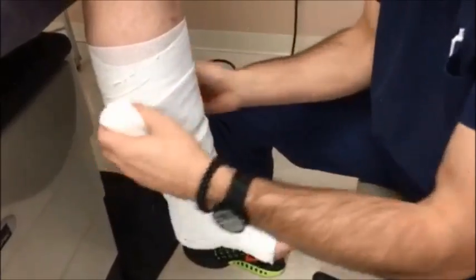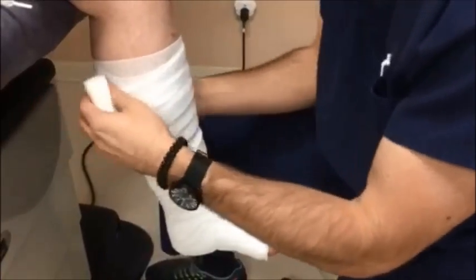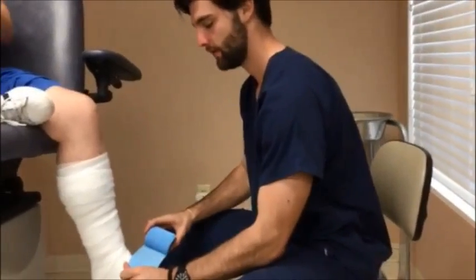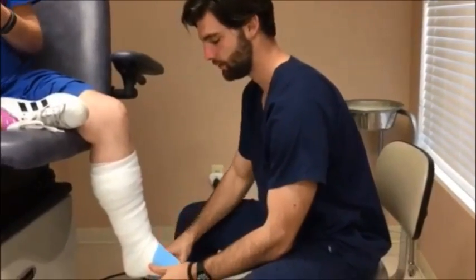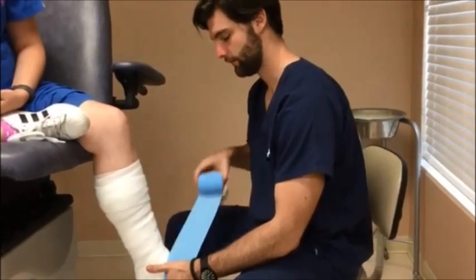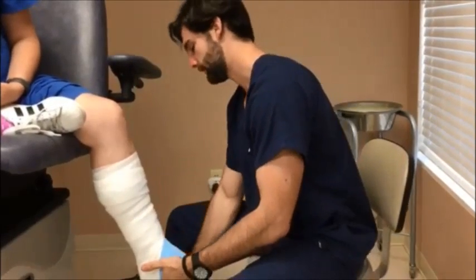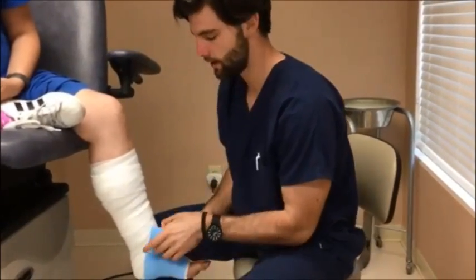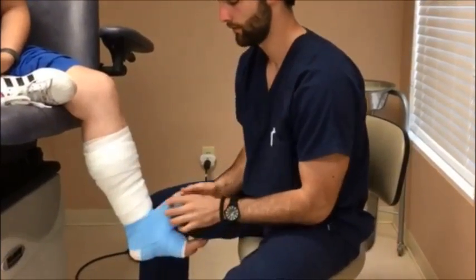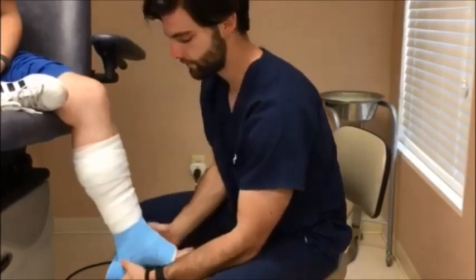Then after the cast padding, we put on Coban to secure it, keep it on the patient, make sure it doesn't get too loose. So as we apply the Coban, we have to remember that this is just a cover for the Unna Boot itself, and that you don't want to actually apply any compression with the Coban itself. You want to make sure you're just covering it up, and otherwise, if you did apply too much pressure with the Coban, it could cut the circulation off or defeat the purpose of the Unna Boot itself. And of course, as you go along, you want to make it look pretty and aesthetic for the patient.